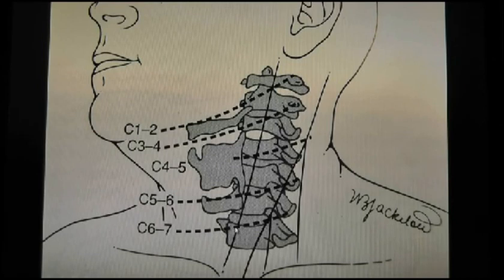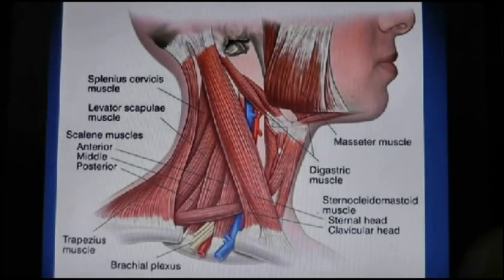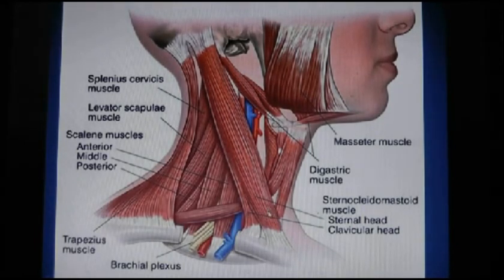And the neck, you can move the incision pretty well because the skin is usually loose. And I usually use an x-ray when I plan the skin incision. So you have to go medial to the sternocleidomastoid muscle, and that's the muscle that goes from your clavicle to the back of your head. So that's the first muscle.